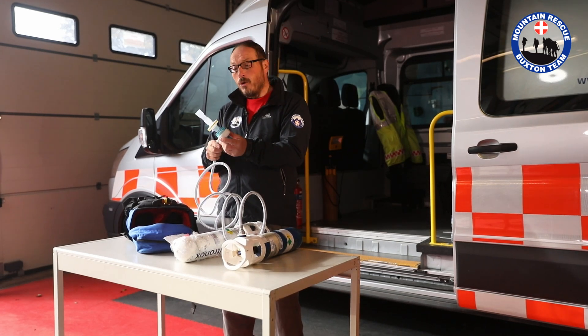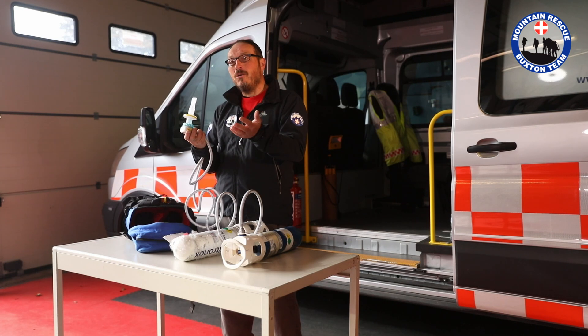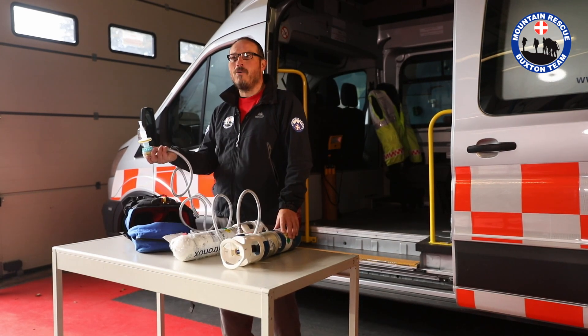A great thing about Entonox I always like to remind people of is it's administered by the casualty, and there's great psychological strength in the casualty feeling that they are helping themselves, even if it's something just as simple as administering a drug themselves. Also, when they've had enough of it, they know they've had enough of it and they just relax and take it away.